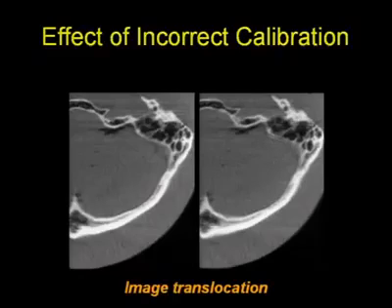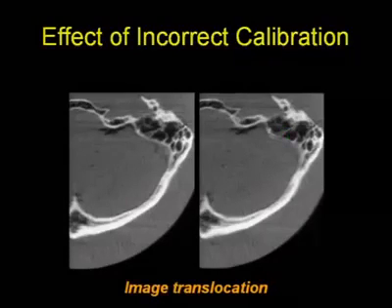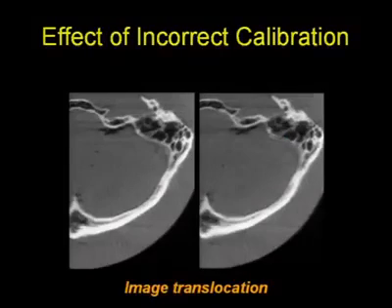Okay, well, you can see that there's a little bit of a blur, especially in the fine elements of the image. This is because the motion that we're trying to correct is of the order of a few millimeters, so objects that are the size of a few millimeters tend to be more blurry.